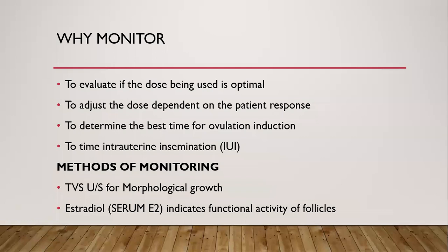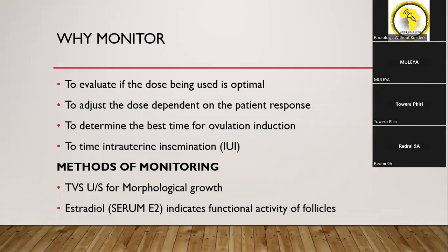So patients get to respond differently. When you are scanning and you see the way the ovaries are responding to treatment, you will be able to advise the doctors through your report the dosage that they need to use for this patient as they stimulate the ovaries.